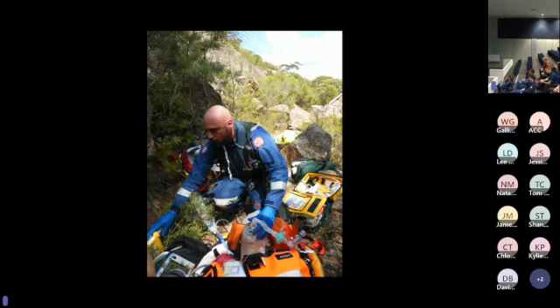Part of it was that there seemed to be this really handy bit of kit that could ventilate a patient, and we use it all the time, called a ventilator, and we don't use it when we're on the winch hook. And part of that's a legacy piece, right? Early on, we had some issues where the BVM was squashed shut by the downdraft of the aircraft. And so that led to a change in the system, which meant that we used a bag that had a stiffer or more rigid, self-expanding nature. Does that make sense?